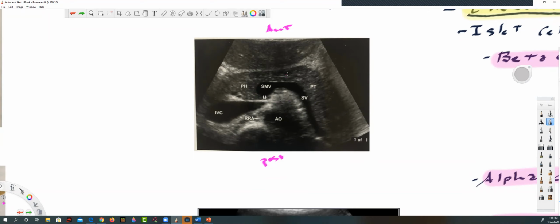Head, neck, body, and tail. We're going to get to a point where the book says that the tail is thin, and I'm sure it is, but it always seems thicker to me. Body thickness, head thickness. It's shadowed out, so it's hard to say, but that tail, for me, always seems wider than the body, and your book says it's the other way around. That might very well be true. It might just be an illusion that the tail is always larger.